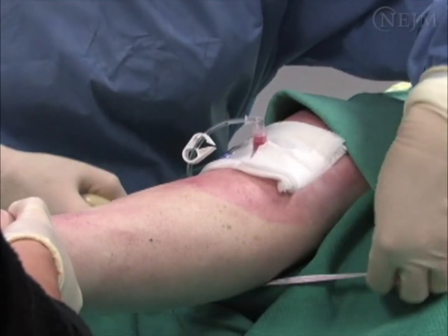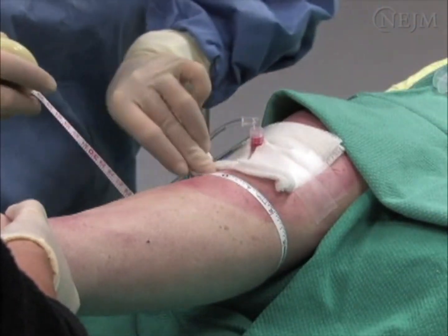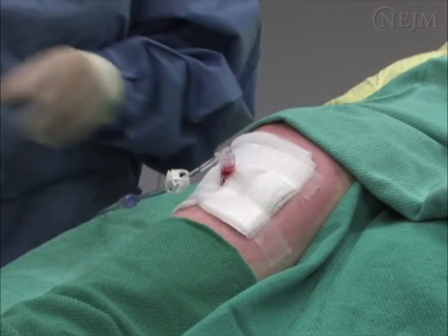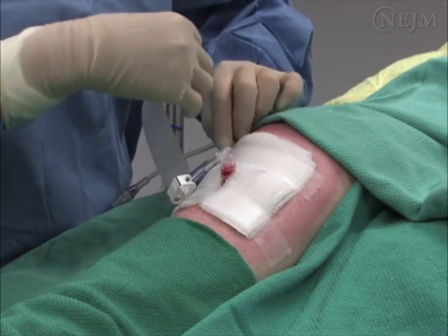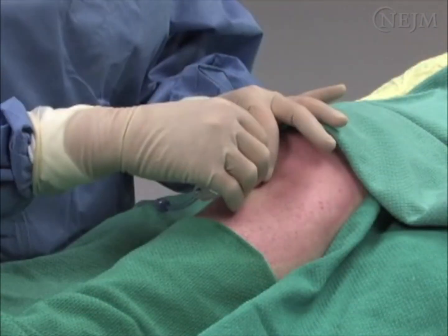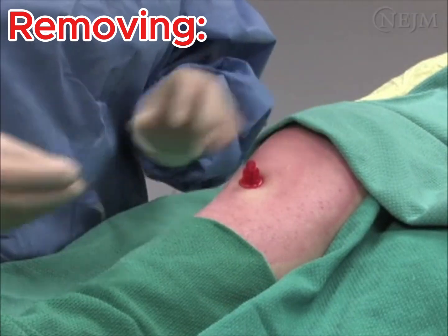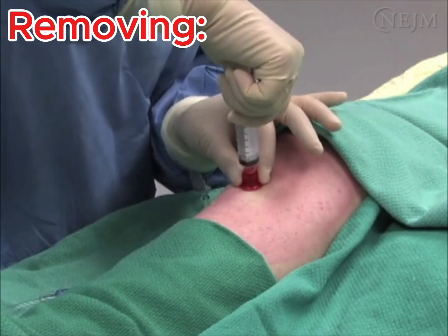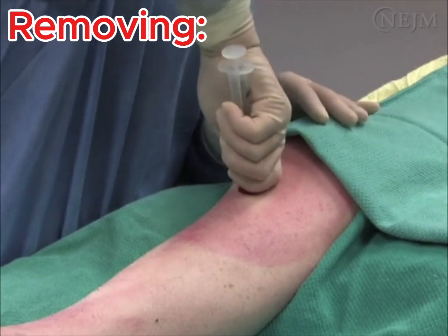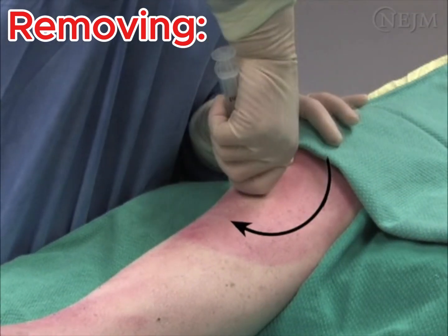While infusing fluids, watch carefully for extravasation and increased calf circumference. The needle and tubing should be secured to the leg with tape, and the leg should be immobilized to prevent dislodgement of the needle. To remove the catheter, disconnect the intravenous tubing and attach a sterile syringe to the hub. Stabilize the leg and gently pull back while rotating the needle clockwise.